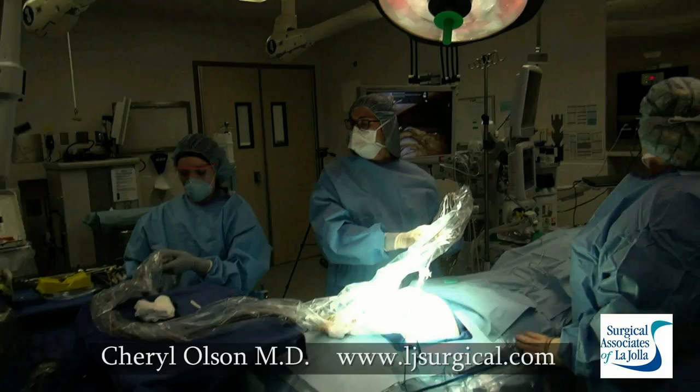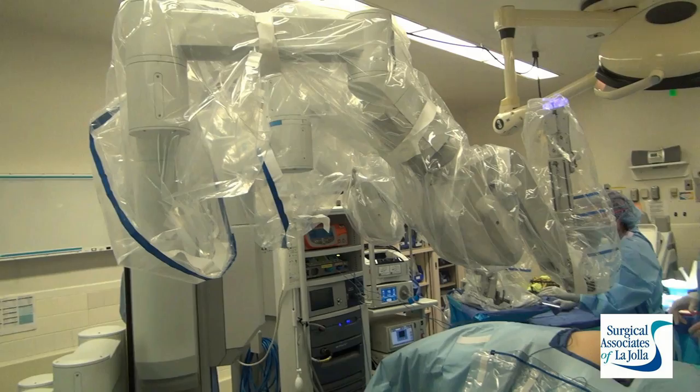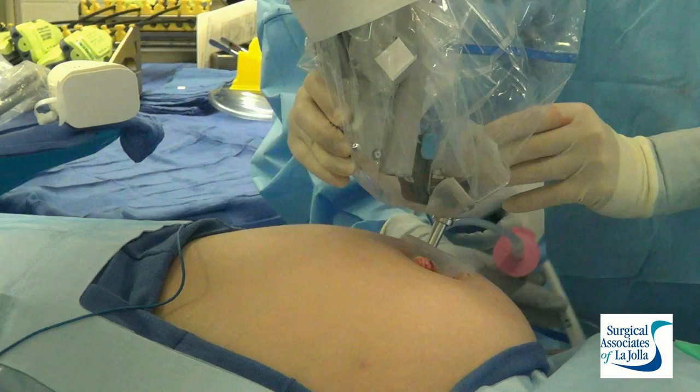We inspect the abdomen with the camera free just to make sure we're in good position. We have to adjust the table before bringing the robot in. There's Jimmy driving the SI system in for docking.